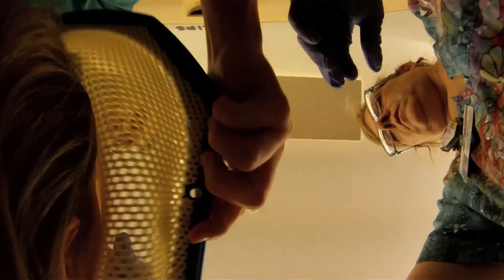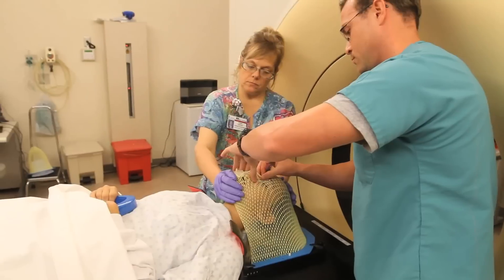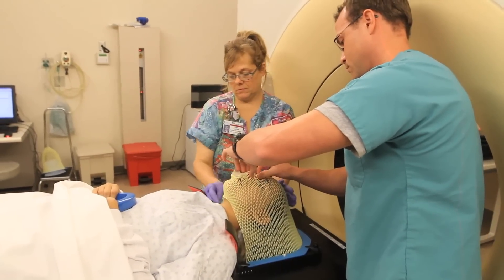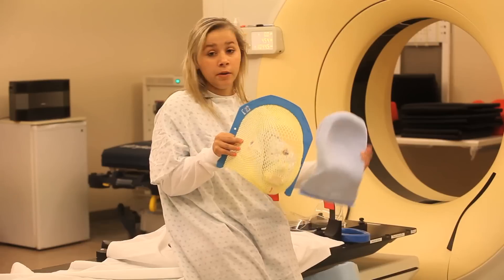When they first put it on, it feels kind of weird, but then it tickles when it gets down to your cheek. I could breathe through it and see through it. And this pillow is very comfy.